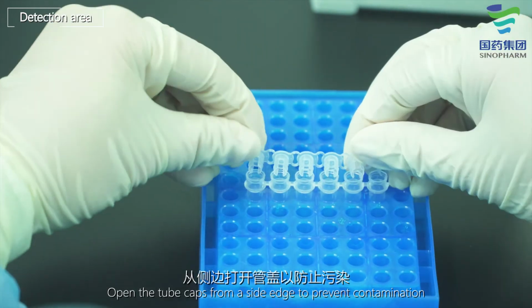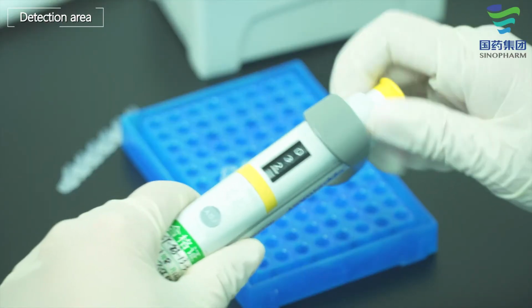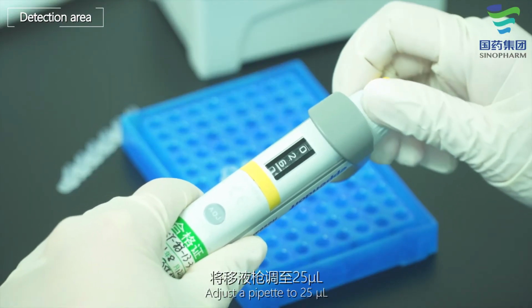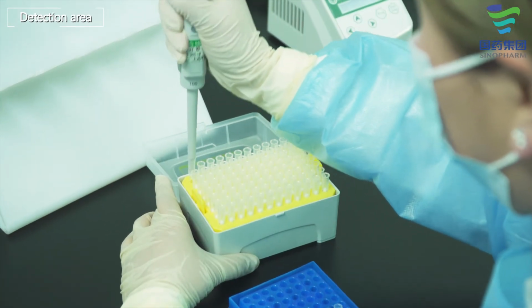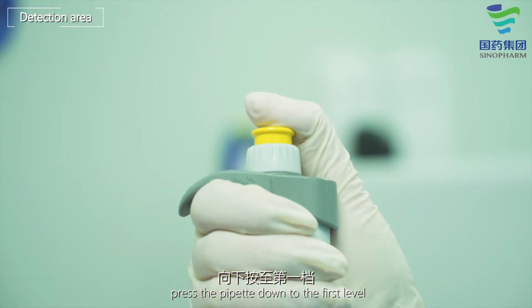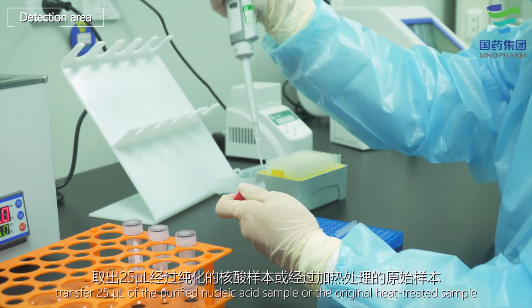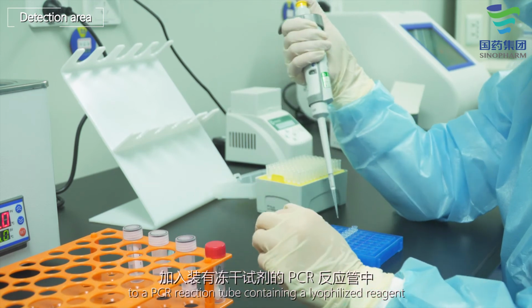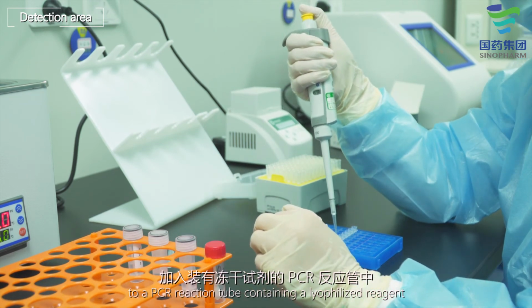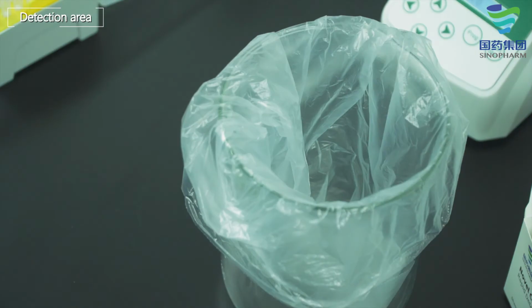Open the tube caps from the side edge to prevent contamination. Adjust a pipette to 25 microliters. Press the pipette down to the first level. Transfer 25 microliters of the purified nucleic acid sample or the original heat-treated sample to a PCR reaction tube containing a lyophilized reagent. Then press the pipette down to the second level and discard the pipette tip.